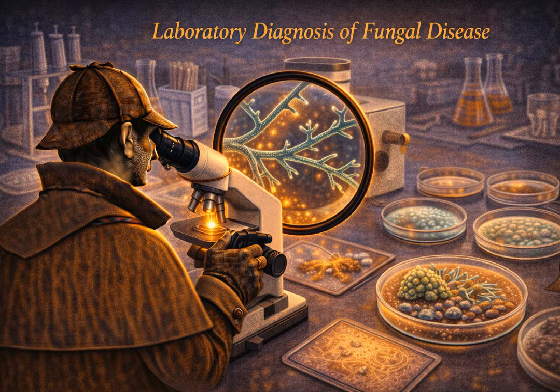So if you are sloppy with your collection, say you take a swab and you accidentally brush it against the patient's cheek or tongue on the way out of the throat, you're going to pick up environmental molds or harmless commensal yeasts. And then the lab grows a mold and the doctor thinks, I found the killer. But really, they just found a hitchhiker. Distinguishing between a true pathogen and an environmental contaminant is the hardest part of reading fungal cultures. So, aseptic technique is rule number 1. You have to meticulously clean the site, use sterile containers, and minimize any exposure to the room air.